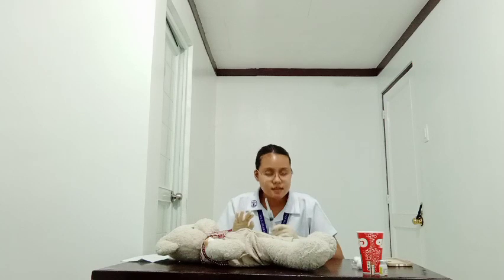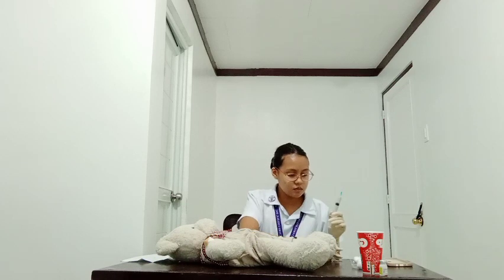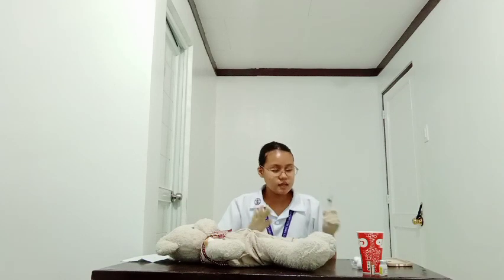So we need to prepare the syringe for injection. This is the syringe that we will be using. Remove the needle cap while waiting for the antiseptic to dry. Pull the cap straight off, avoiding contaminating the needle by the outside edge of the cap. Okay, we throw this later on with the needle.